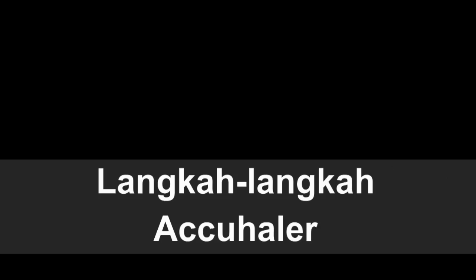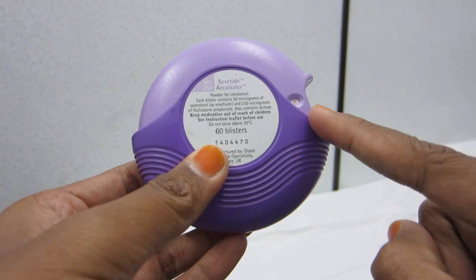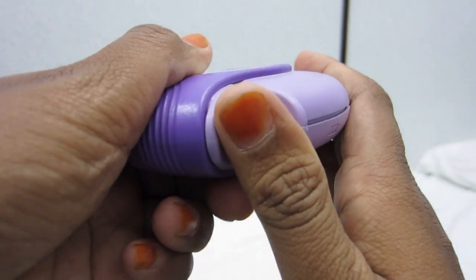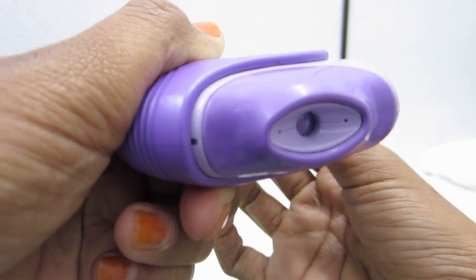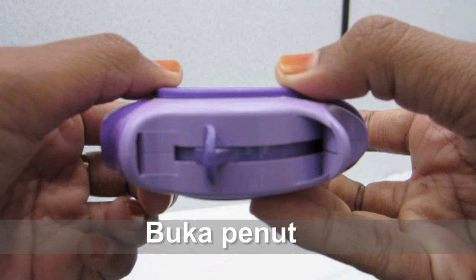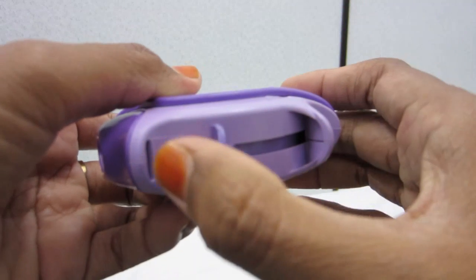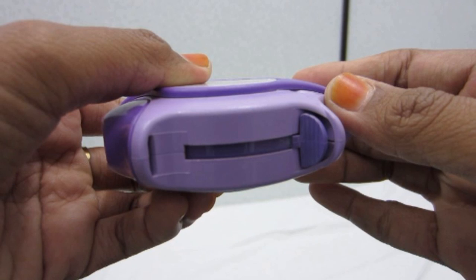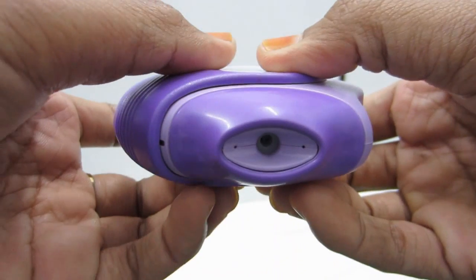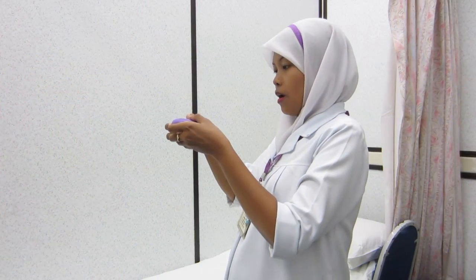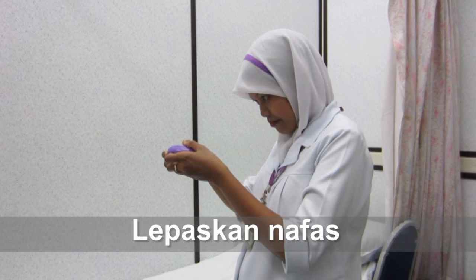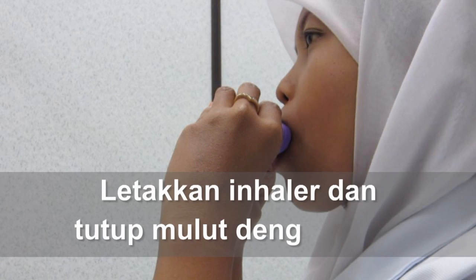Berikut adalah langkah-langkah penggunaan Accuhaler. Periksa dos kaunter pada inhaler. Buka penutup sehingga bunyi klik. Tarik butang juga sehingga bunyi klik. Lepaskan nafas dahulu. Letakkan inhaler pada mulut.